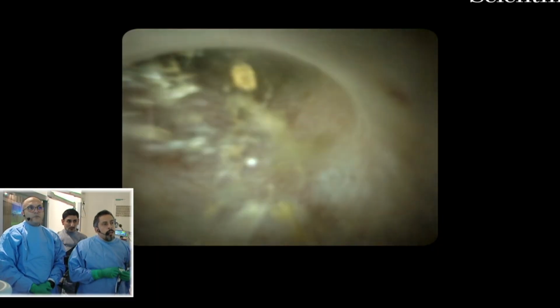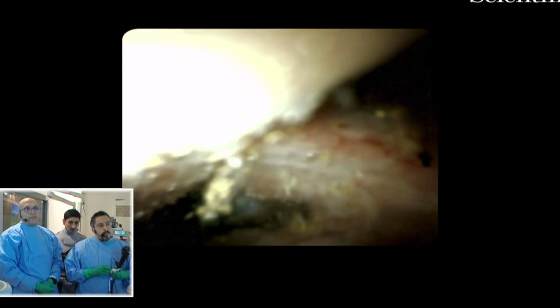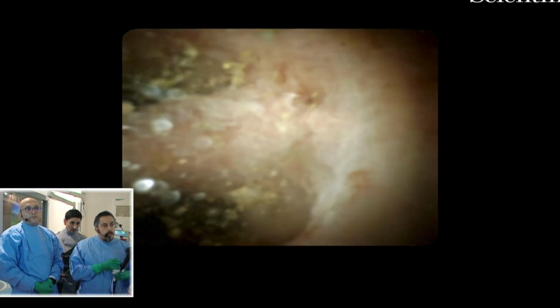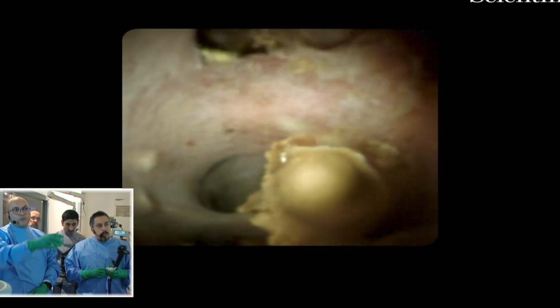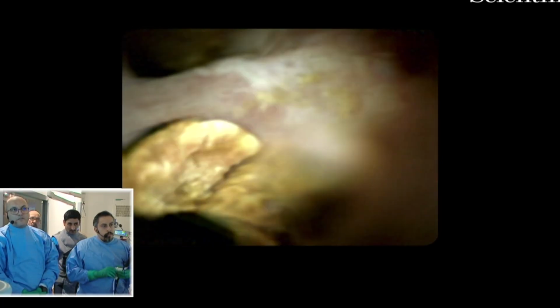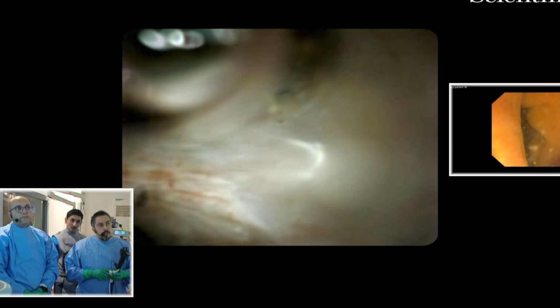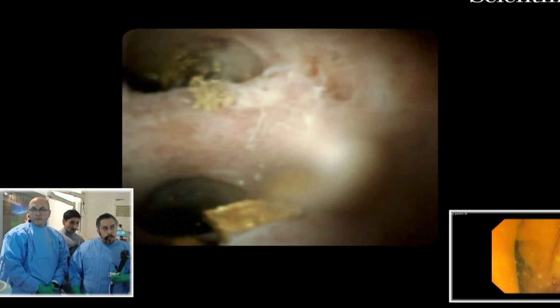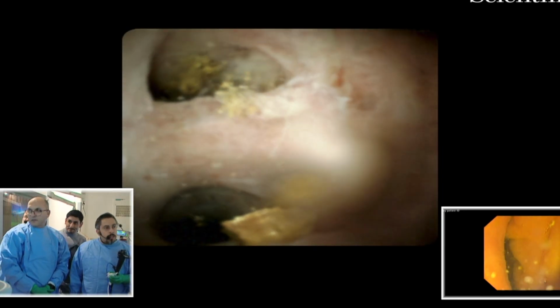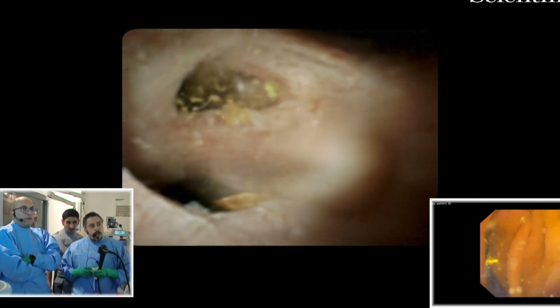And the question Dr. Hamad was asking was whether there are any intrahepatic stones or not. Frankly, there are no intrahepatic stones, Dr. Hamad, and this is a small residual stone after crushing of the main stone. Since it's a single stone, it was not difficult to crush it in a single session and in a short period of time.